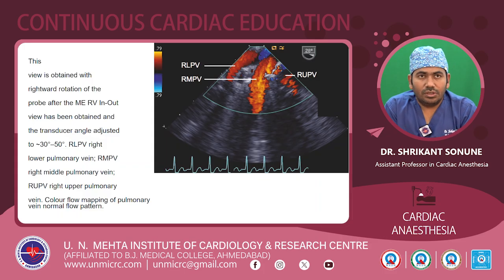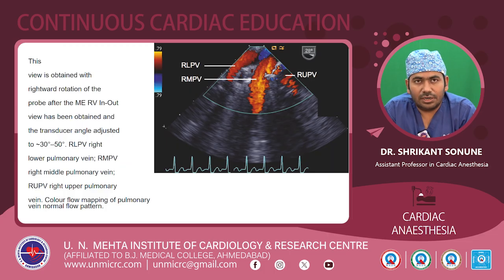So this is another echo image. This echo image can be viewed by obtaining the rightward rotation of the probe after achieving the mid-esophageal right ventricular inflow-outflow view at an angle of around 30 to 50 degrees. As we can see in the echo image, the right lower pulmonic vein, the right middle pulmonic vein and the right upper pulmonic vein are visualized with respect to the color flow mapping, and as such there is no obstruction, suggestive of the normal flow pattern.